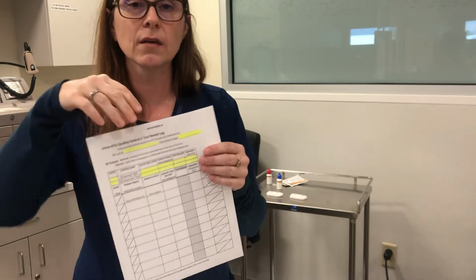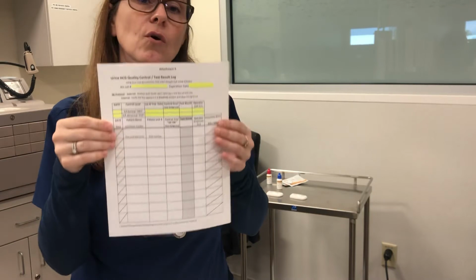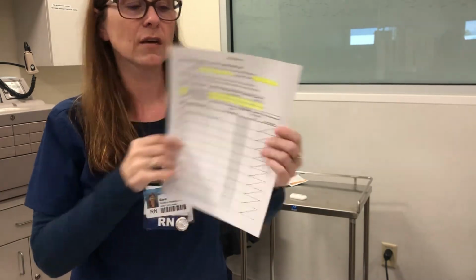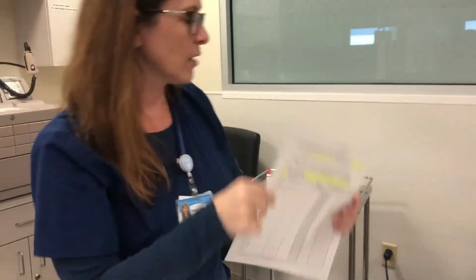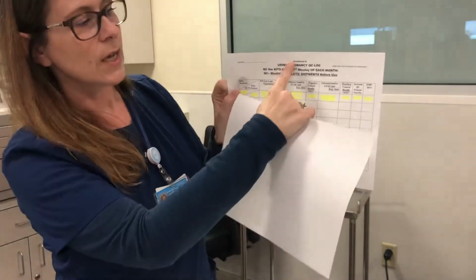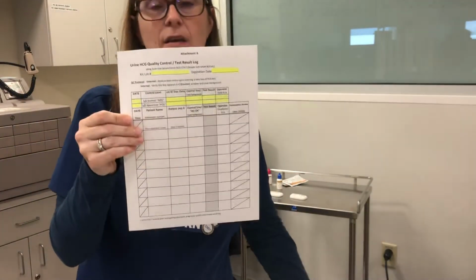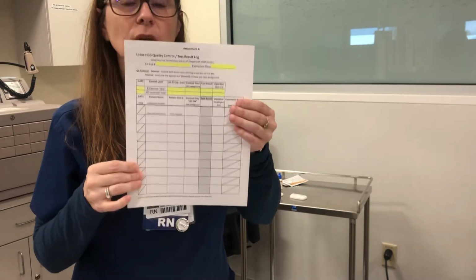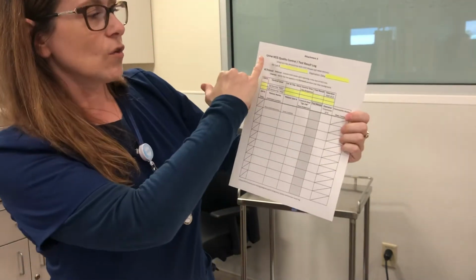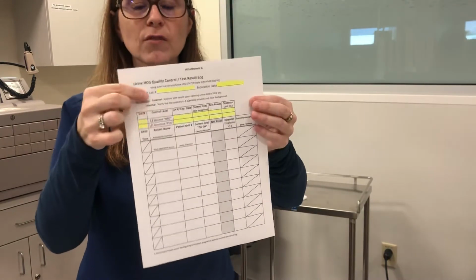Then you need to transfer the new QC data to the top of the form that we use monthly for actual resulting. So all of the patient data goes on this next form, which is called attachment A. And actually, let me back up. Sorry. The one where you're recording the QC information is attachment B, urine pregnancy QC log. So attachment A is what we use to record all of our patient pregnancy tests. It's called the urine HCG quality control test result log. All of our QC information needs to be transferred at the top.